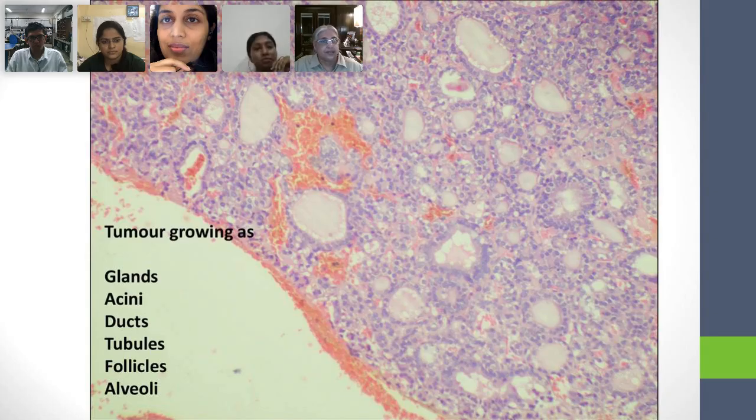Gland, acinus, or let me say, what won't you pick? First, let us say what you will not pick. Come on, Ashish, what will you not pick out of all of this? Ducts and alveoli. Acini. Okay, so you will not pick acini, you will not pick ducts, you will not pick tubules, because tubules are small things, right? And alveoli. Very good. So you're left with gland and follicles. All right, good. What about you, Kshitija? What will you not pick?